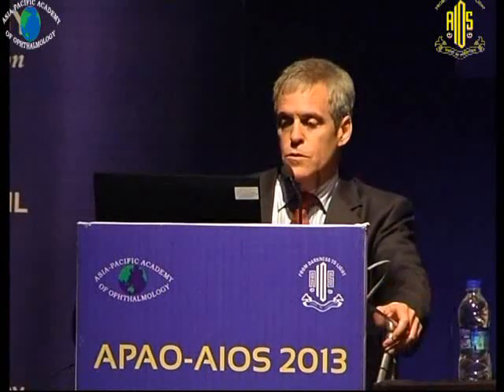You may need to manually enlarge the wound to manually remove the nucleus. It depends on how severe the rupture is. You may have such a small capsular rupture that you can do a posterior capsular rhexis and still put the IOL in the bag. For the posterior segment surgeon, I've used a posterior infusion. It allows me to do a full pars plana vitrectomy, perhaps a little bit more pressure on insertion of the 25 gauge or 23 gauge cannula.